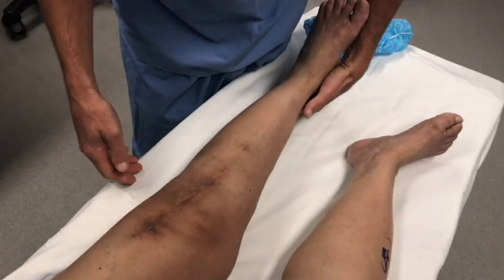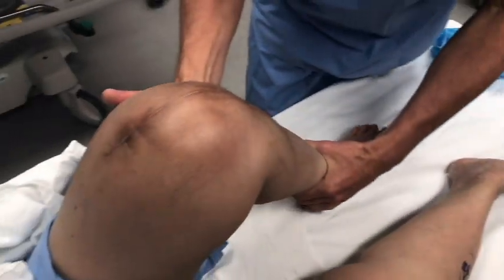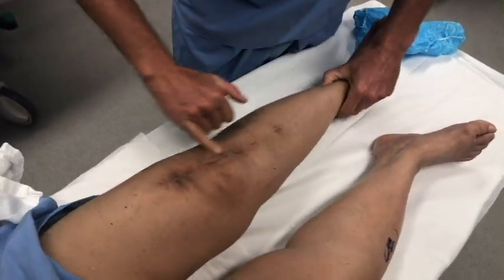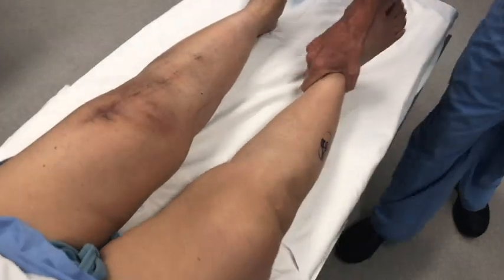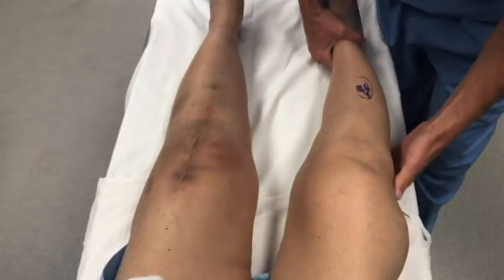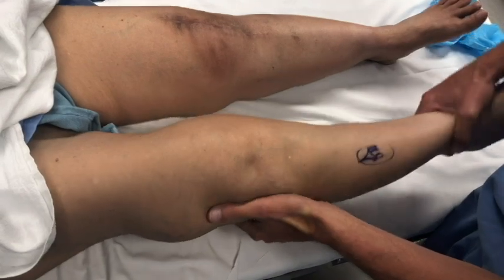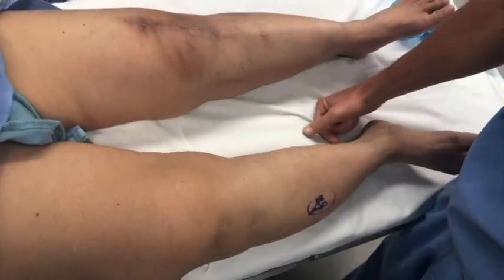Brad, here we are in the OR. This is the other knee that we replaced approximately three months ago. You can see that it bends, completely straightens, and is stable. Looks good — well-healed incision. This is our navigation portal. And then on this side, you can see that she's actually quite crooked. In full extension she has a significant wobble side to side and does not quite get all the way straight. So our goal is just to reproduce what we already did three months ago.